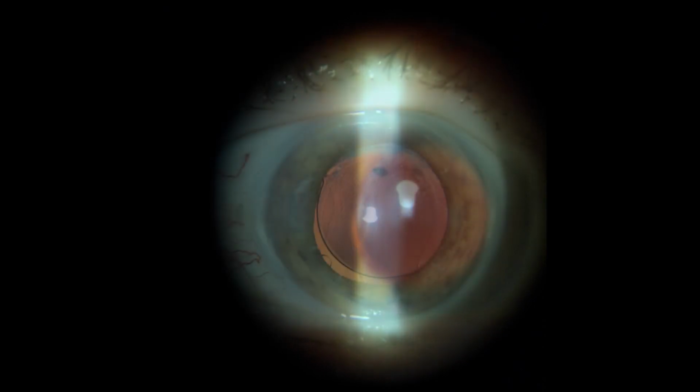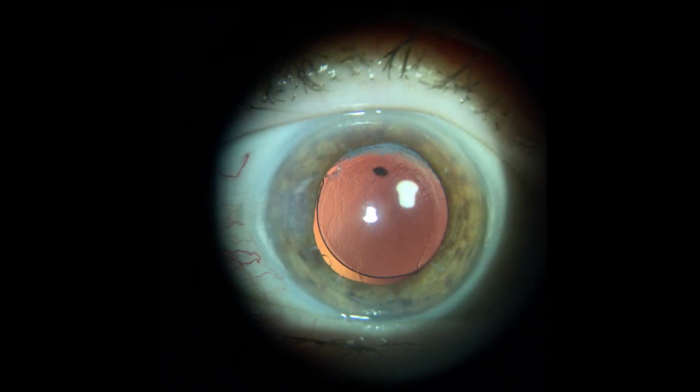This is what she looked like at her 2-week visit. I took the suture out and her vision improved to about 20/25 uncorrected, and she was very happy with her result.